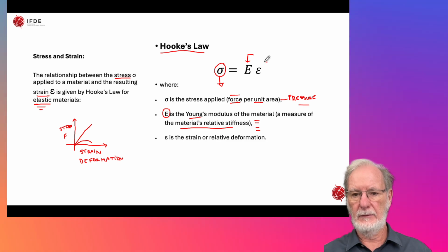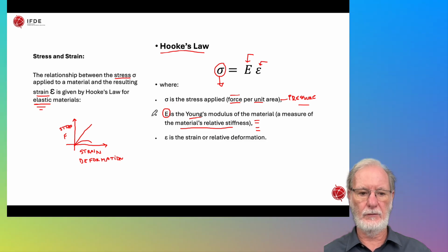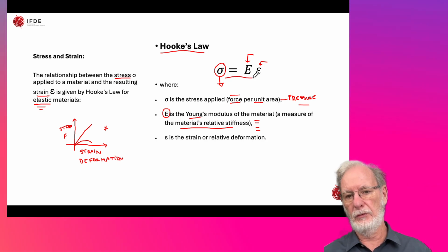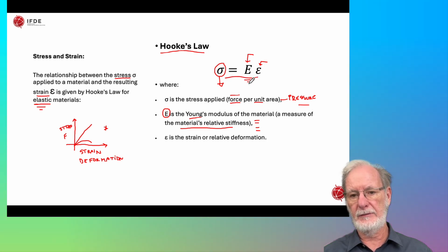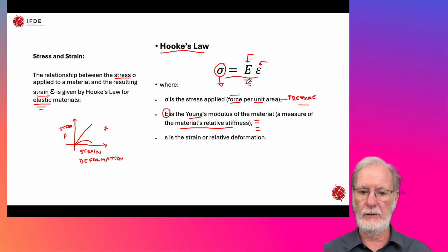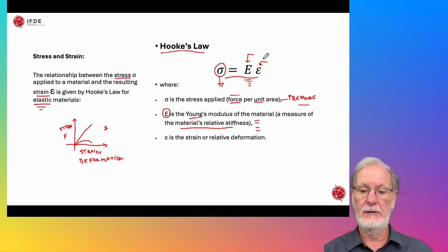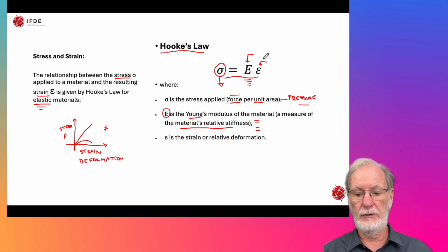times the deformation. So stress-strain curve, this is exactly this one here. So it is pretty proportional, and it will be proportional depending mainly on the characteristics of the material and the amount of deformation. All these have to be taken into account when you are preparing your staging for the aligner treatment.